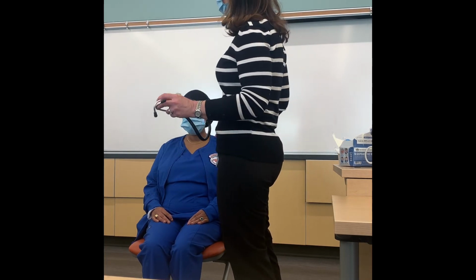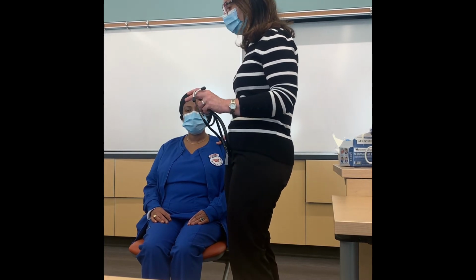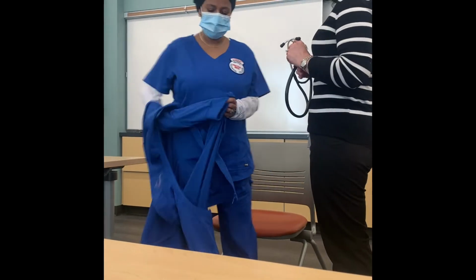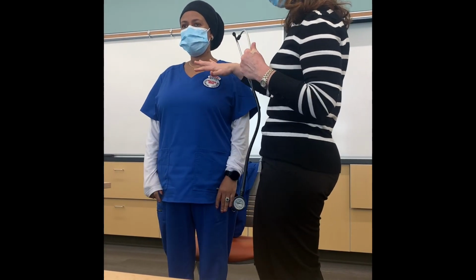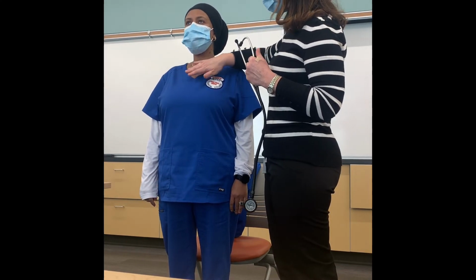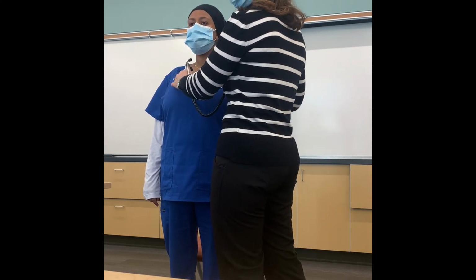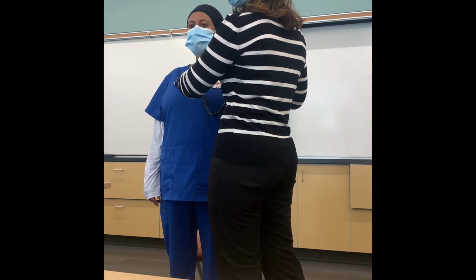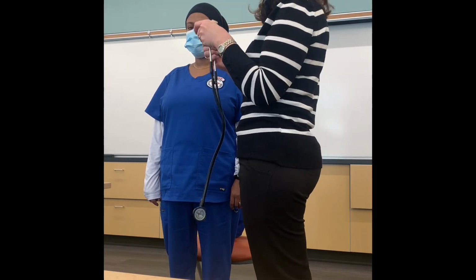Okay, so we listen on the front, and so I'm gonna have you stand up for us. And can you take this top off? Okay, slowly delayering. Okay, and so I'm going to show you where I listen, just the placement of the stethoscope. I could sneak my stethoscope right here, but then you're not going to be able to see where I put it. So I am going to start here, but then I'm going to move over her shirt. Not because it's the best practice, but because I want you to see the placement.